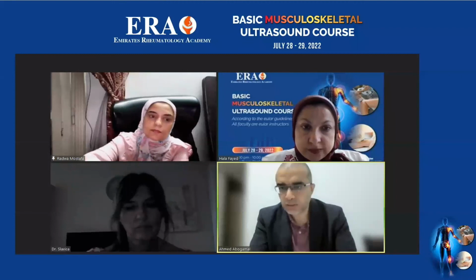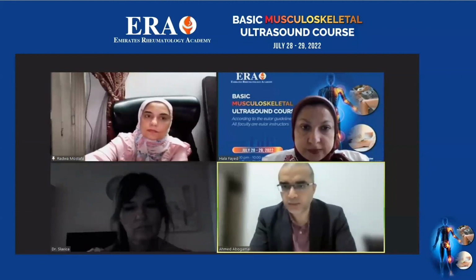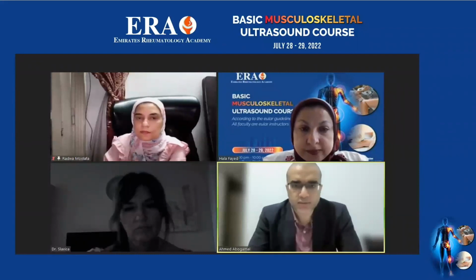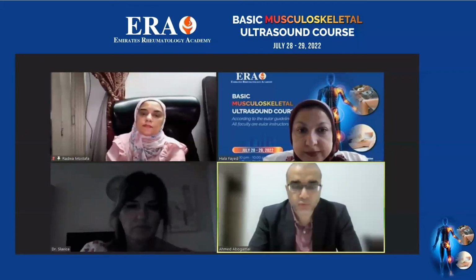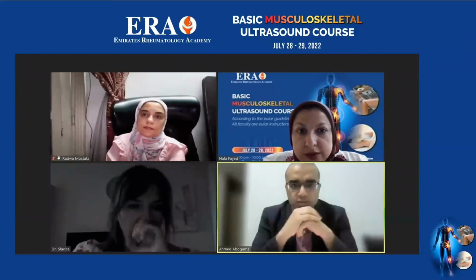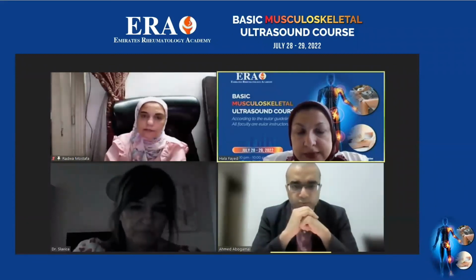All the questions answered. I'd like to ask Hala, who gave us a very nice talk about the rough topic, which is Doppler: what advice are you giving to all the juniors who start to practice ultrasound regarding Doppler? What is the most valuable advice for them from your side?